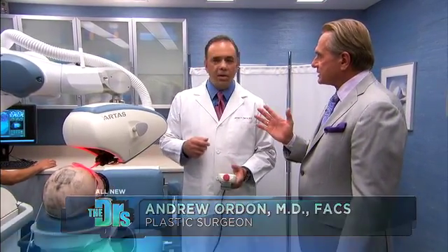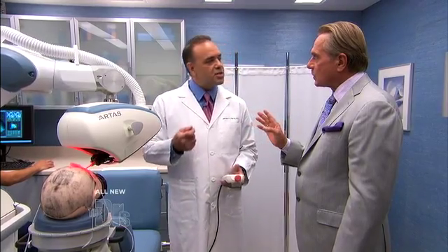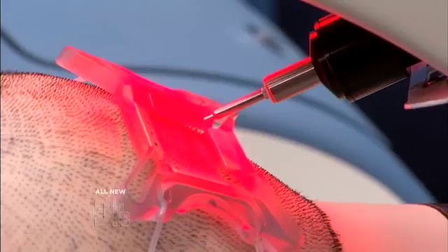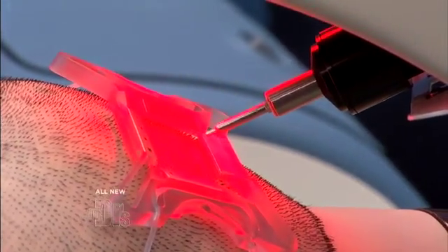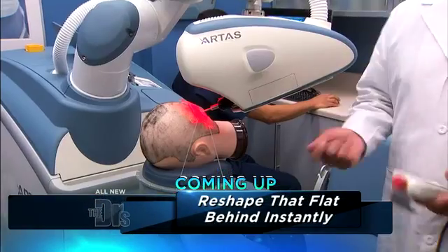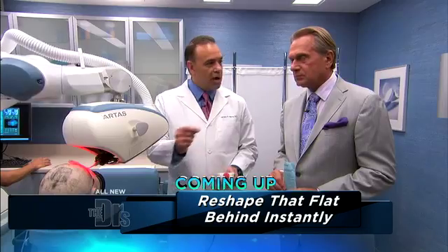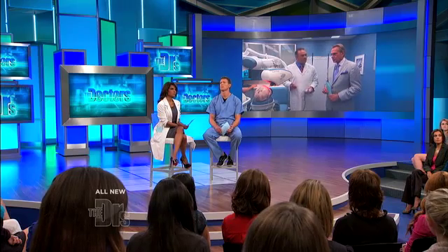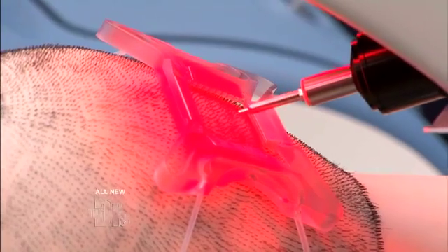I would think this is going to be much quicker than the old fashioned techniques, isn't it? When it's going through this process, it's actually doing about a thousand grafts an hour, which is very, very fast. That is moving very quickly. It's an amazing technology. The main advantage for the patients is that it's minimally invasive. It doesn't leave that long line scar at the back, so they can wear their hair short if they want to. There's more rapid healing and they can get back to activities much, much more quickly.